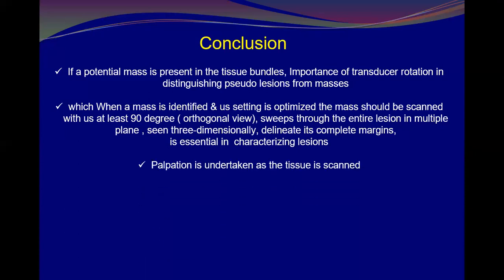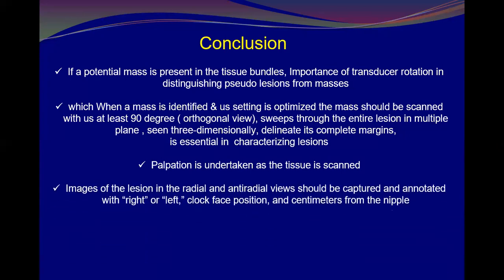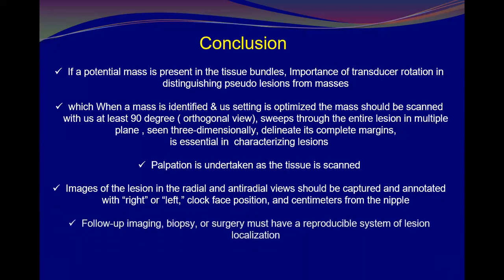And we have to consider palpation while scanning, and images of the lesions in radial and anti-radial views should be captured and annotated with right or left, clock position, and centimeters from the nipple. This will definitely make it reproducible for surgery, biopsy, and follow-up.